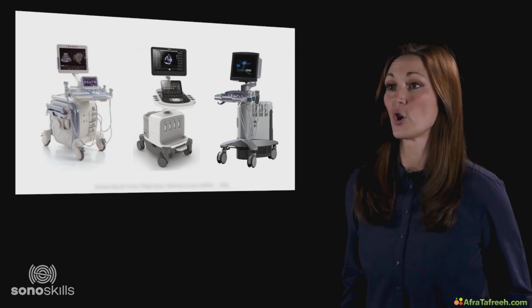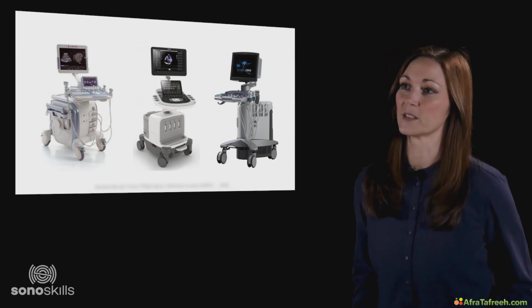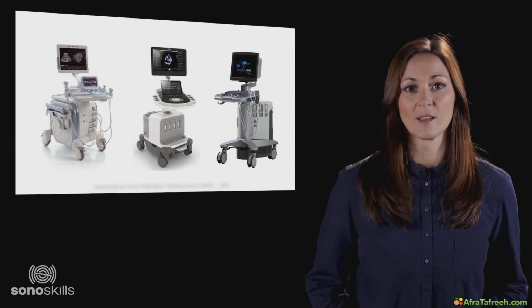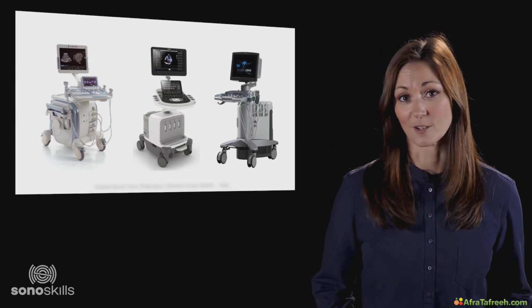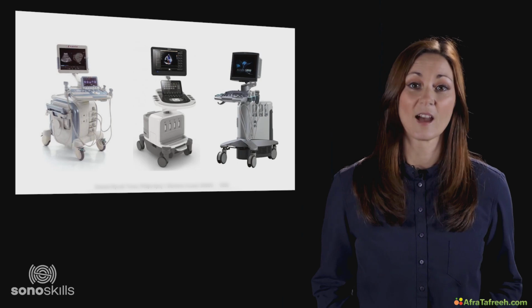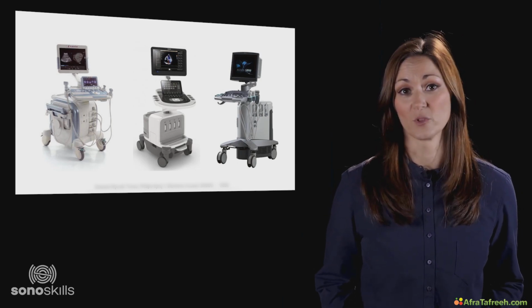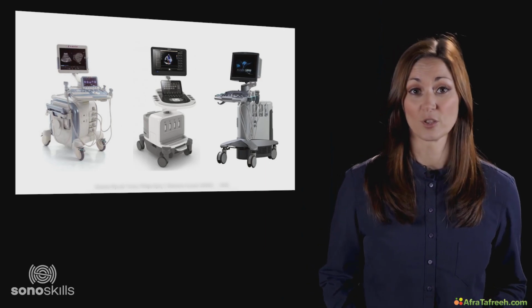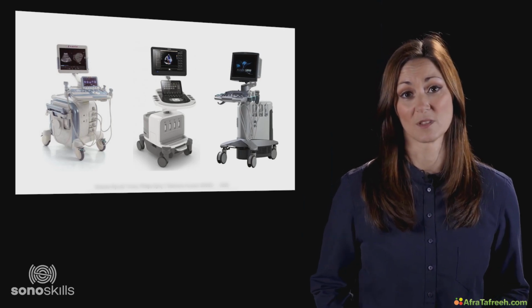The ultrasound systems commonly used in secondary care are generally bigger in size and better in quality if scanning more complex and detailed anatomy. These systems are also more expensive as quality comes with a certain price in ultrasound. There are cheap systems available on the market, much cheaper than all the systems shown in this presentation. However, both diagnostic accuracy and clinical usability are much lower with these cheaper systems.